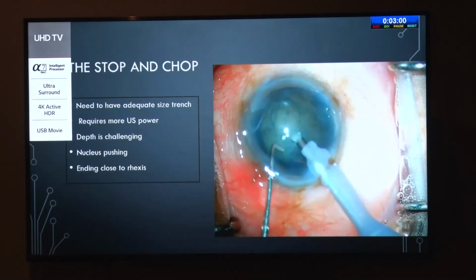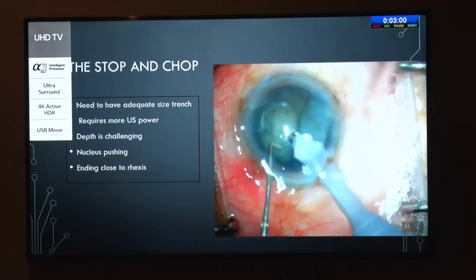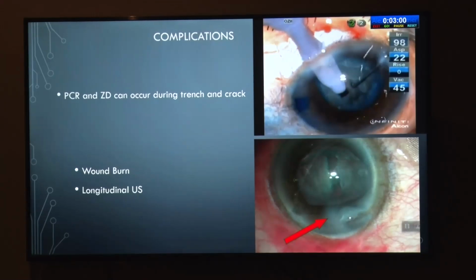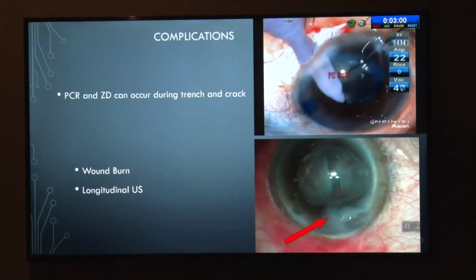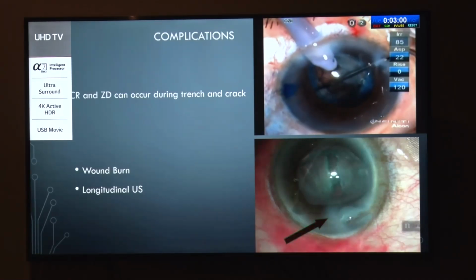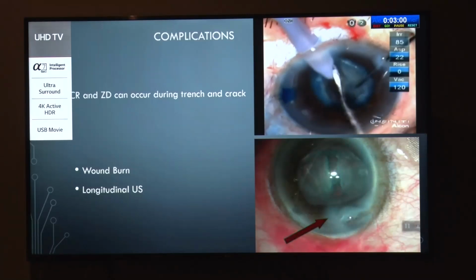So the advantage from the traditional stop and chop technique is that you are using a torsional technique rather than a longitudinal phaco, and it is difficult in small pupil and harder grades of cataract. It also pushes the nucleus, thereby putting stress on the zonules, and it is very close to the rhexis margin. This may lead to PCR while doing the trenching and breaking the nucleus, or while cracking, and may also lead to zonular dehiscence because of the forces exerted.